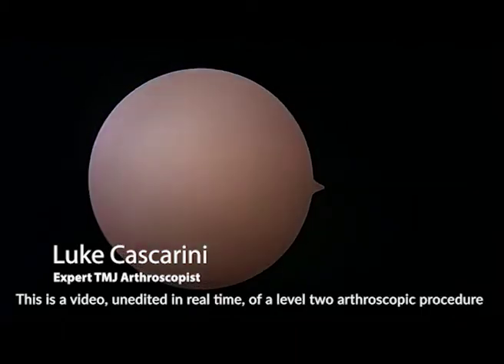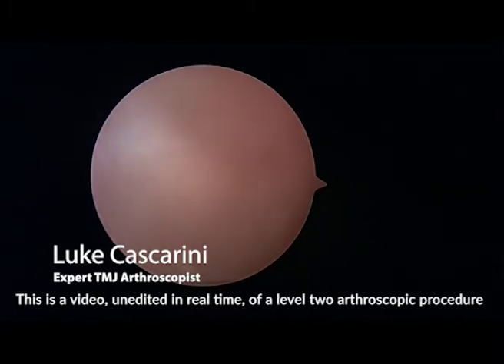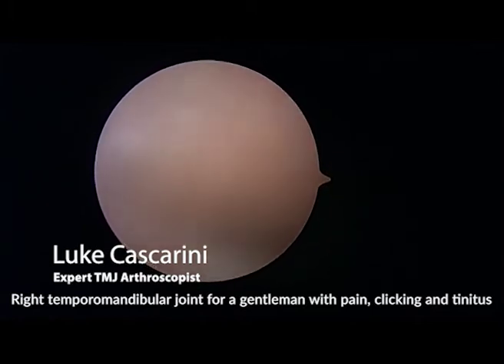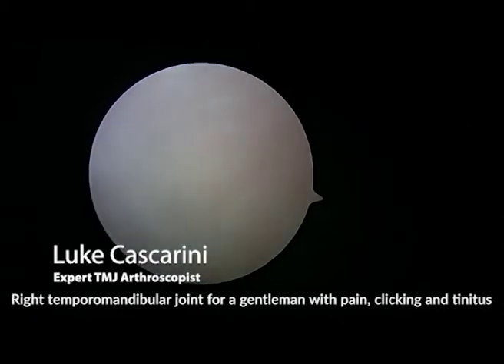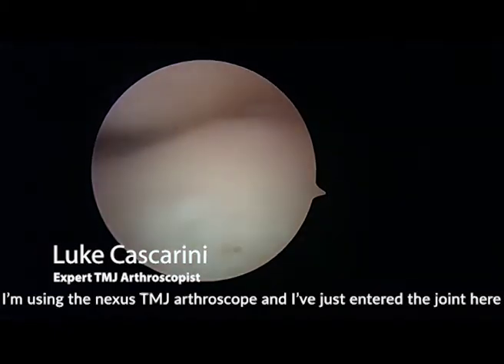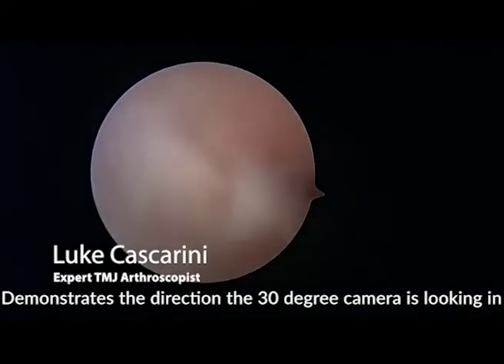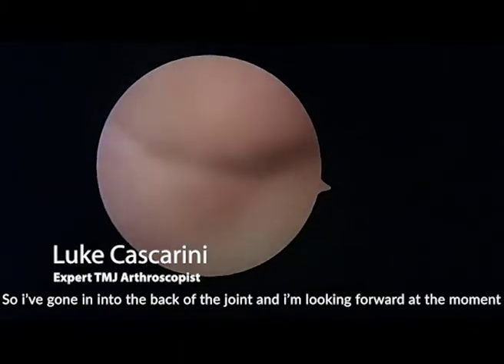This is an unedited real-time video of a level 2 arthroscopic procedure on the right temporomandibular joint for a gentleman with pain, clicking, and tinnitus. I'm using the Nexus TMJ arthroscope and I've just entered the joint. The arrow on the right of the screen demonstrates the direction the 30-degree camera is looking in. I've gone into the back of the joint and I'm looking forward.